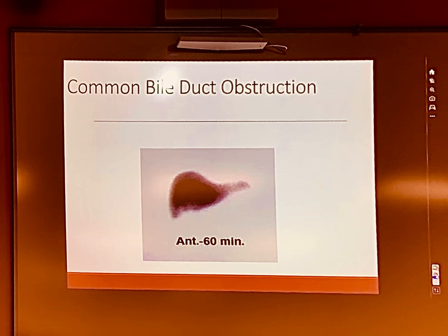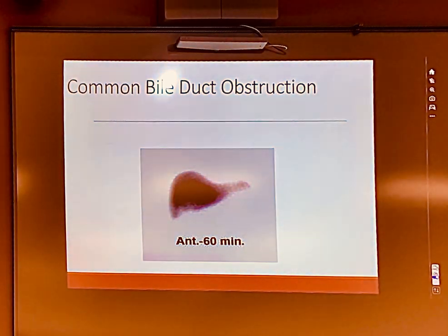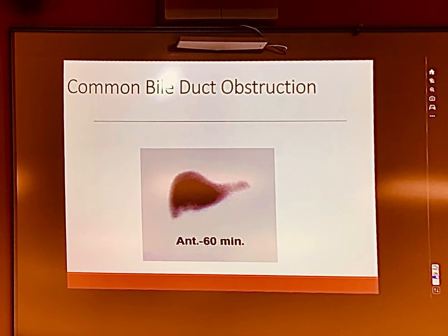So here's a good one. This is a 1-hour picture. Do you think this is a common bile duct obstruction? What do you think is going on in this picture? You're 1 hour out, so this is at the end. It's just liver. So what does that tell you about this patient? There is an obstruction. Where?